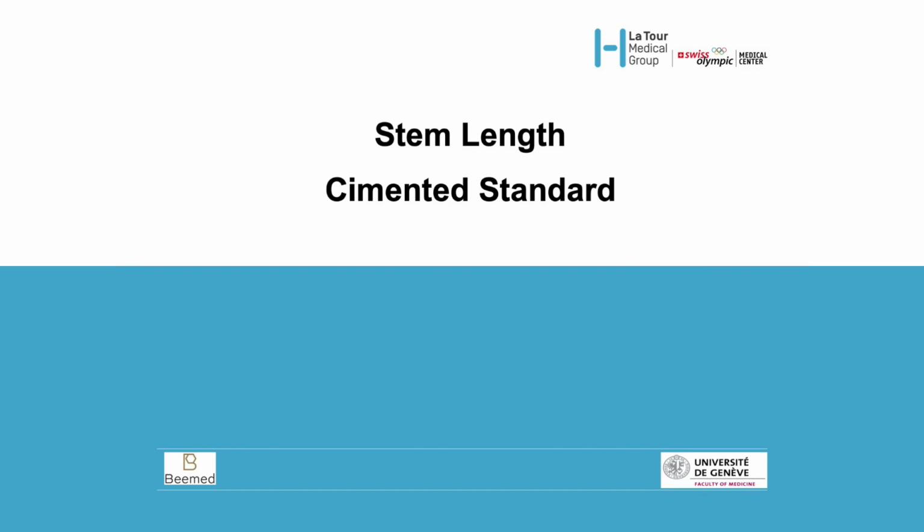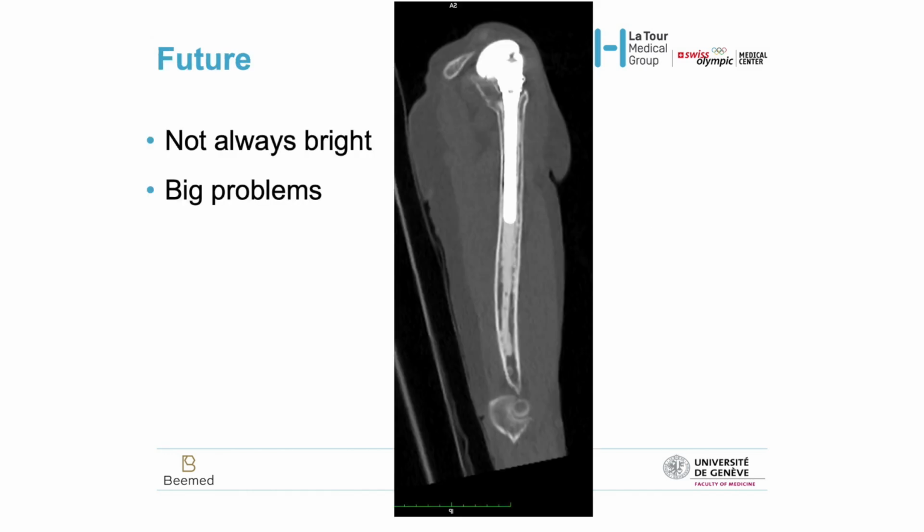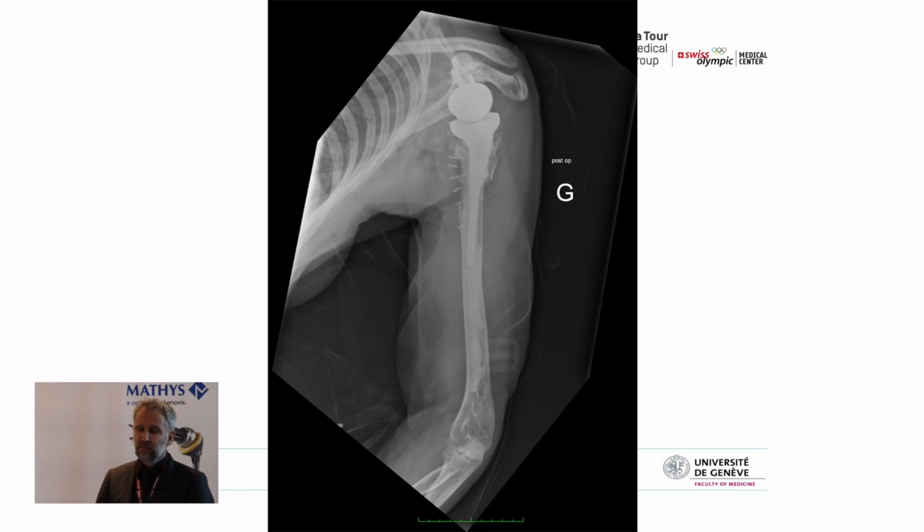And now, let's talk a little bit about long term, because for the future of the reverse, this is the key. Who amongst you loves cement? Question. Who cements prosthesis? Okay. So just to give you one example of the nightmare that we are going to have in the future. This patient was operated in 2006, and she came to me in 2018. She had 12 years of nightmare. She could not go on anymore. So I did this revision, and honestly, I fought with the cement. It was not an easy surgery.